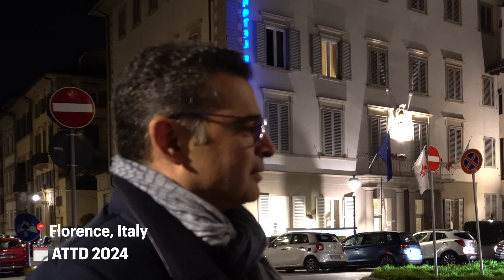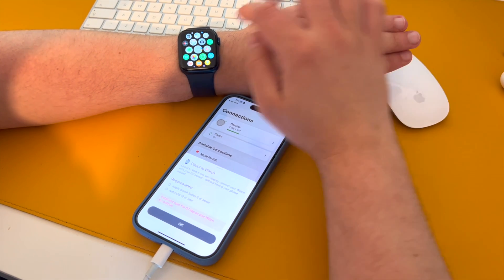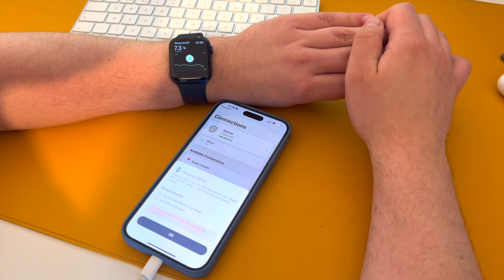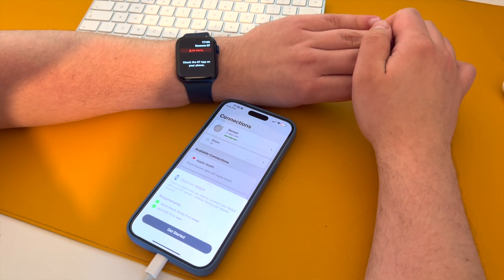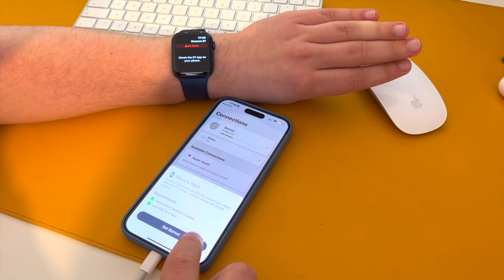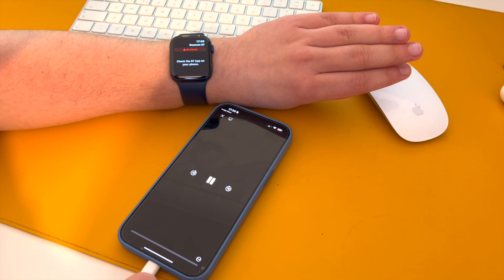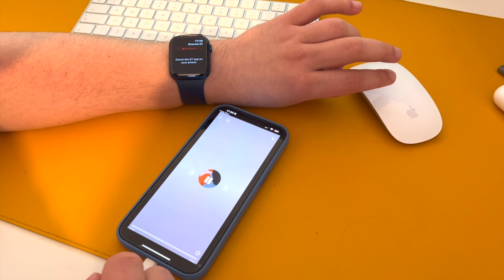We're very excited about being first to bring this Direct2Watch Connectivity to Apple Watch — it's a big thing. The good news is all existing G7 sensors have a built-in functionality, so no need to do anything. Just when the application becomes available in the market, you update the app. There are initial steps to connect, and then every time you change the sensor, it automatically connects through the phone. It's very simple.